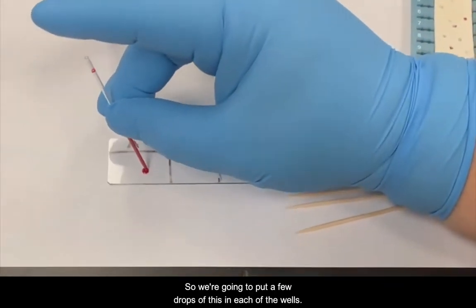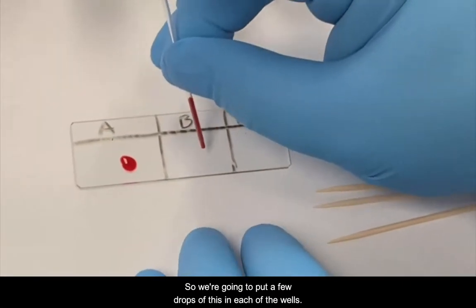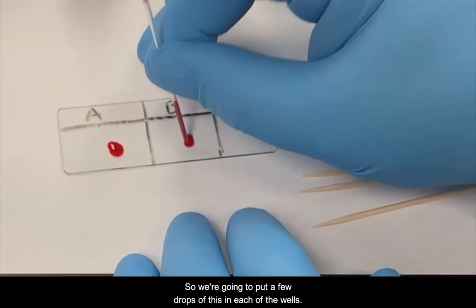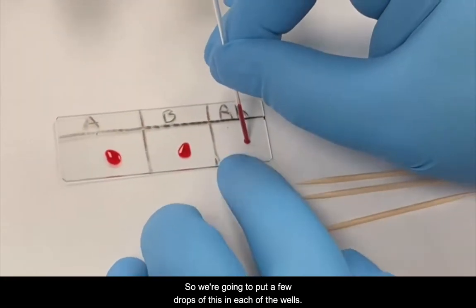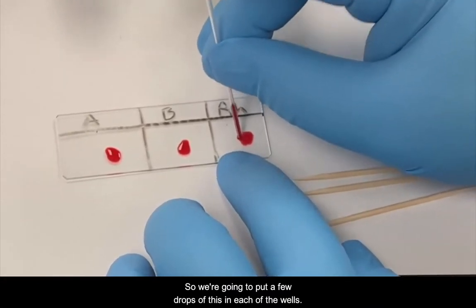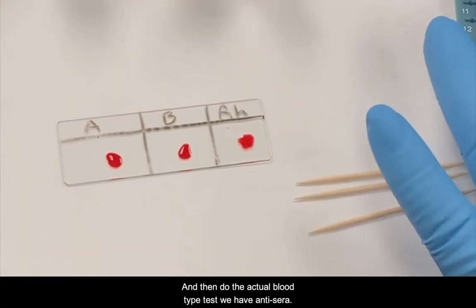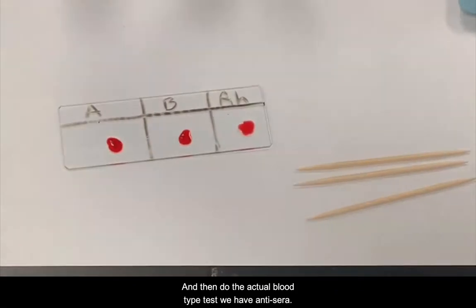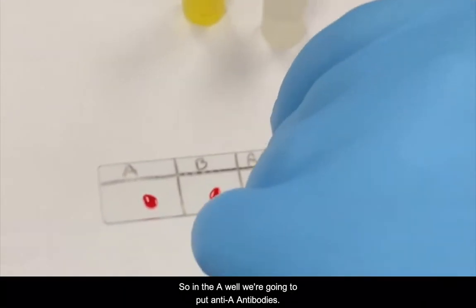We're going to put a few drops of this in each of the wells. To do the actual blood type test, we have anti-sera. In the A well, we're going to put the anti-A antibodies.